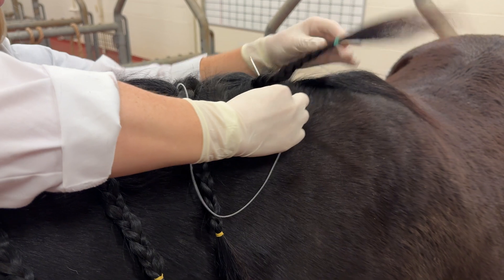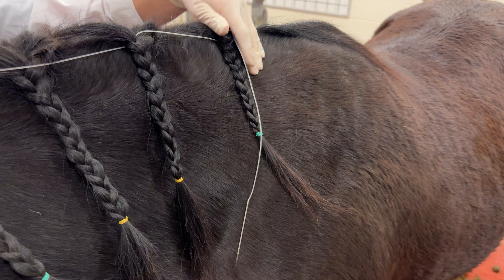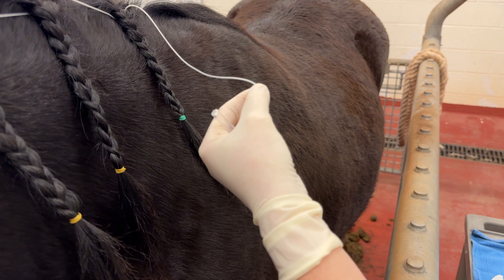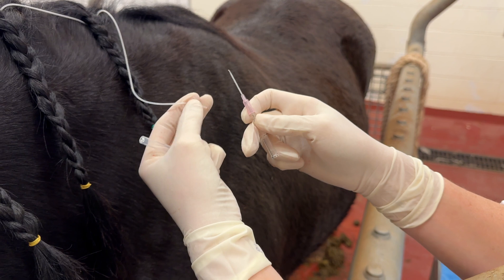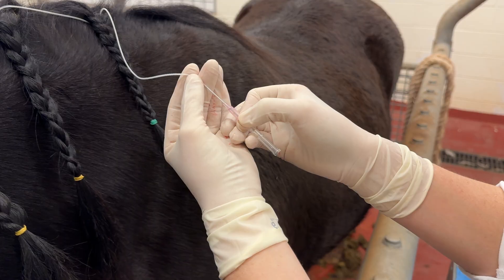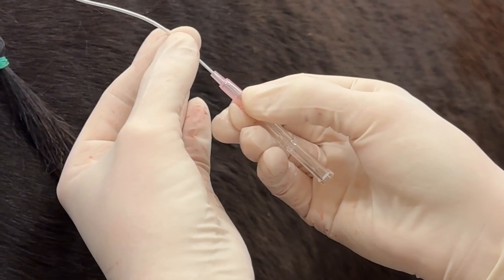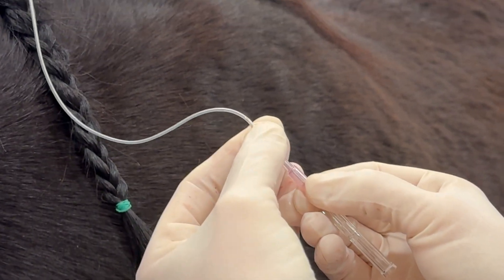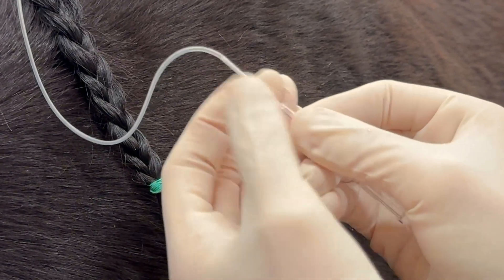Now we're going to demonstrate how to place the end of the lavage line where you can administer your medications through the catheter. You're going to be using a 20 gauge catheter that comes in the kit. You're going to want to protect the lavage line by placing the catheter up and advancing it a little bit so that your stylet is no longer exposed. Pull that stylet back, advance the catheter a little bit, and then place it down and over the lavage line. You're going to have to use some force to pull that lavage line down to the plastic portion of the catheter with the stylet still in place. Without the stylet there's nothing to push against.